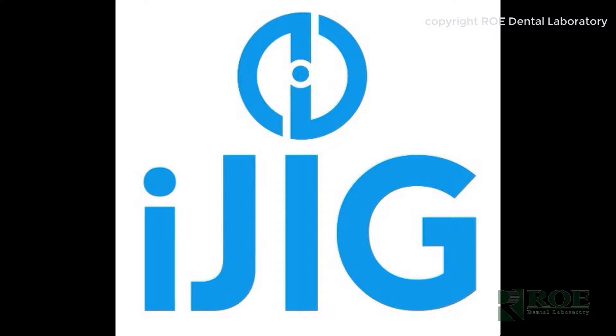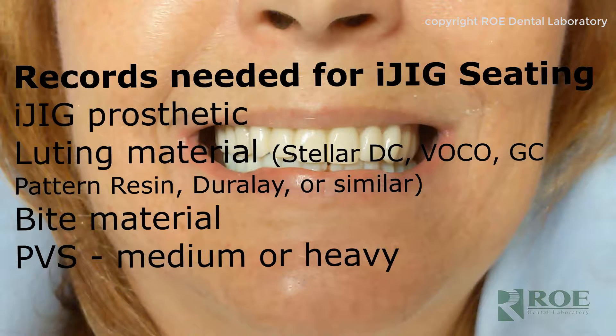This video will instruct the iJIG seating appointment. The records needed are the iJIG prosthetic, luting material such as Stellar DC, GC pattern resin, Duralay, or similar — some type of non-shrinking material to lute the sections together — bite registration material, and polyvinyl siloxane (PVS), either medium or heavy depending on the gap between the prosthetic and the tissue.